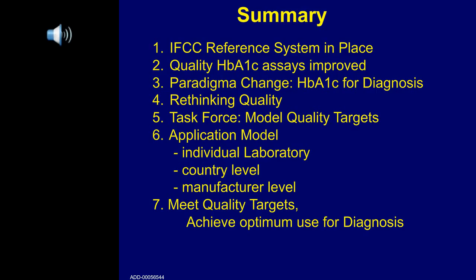Garry? Yes, I think there are a number of devices about, as Kaz said, and I think there were two very good publications by Dr. Lenters in Clinical Chemistry over the last couple of years, which actually show that some devices are extremely good, and in many cases are actually as good as laboratory methods, whereas other methods are actually quite poor and should be avoided totally. So I would advise reading Dr. Lenters' two papers in Clinical Chemistry, published over the last 2 to 3 years.